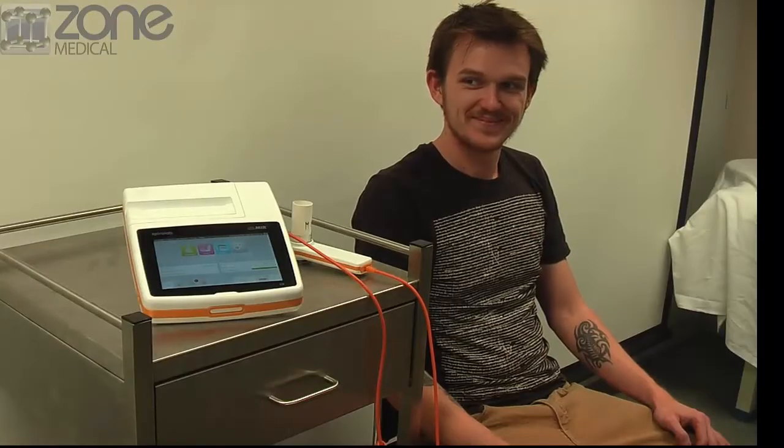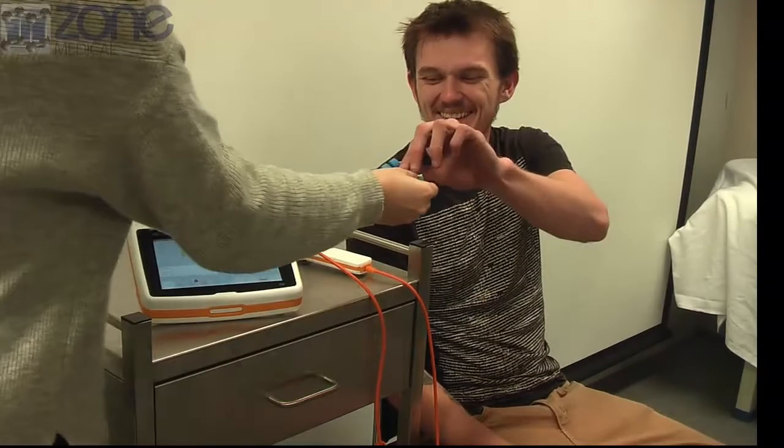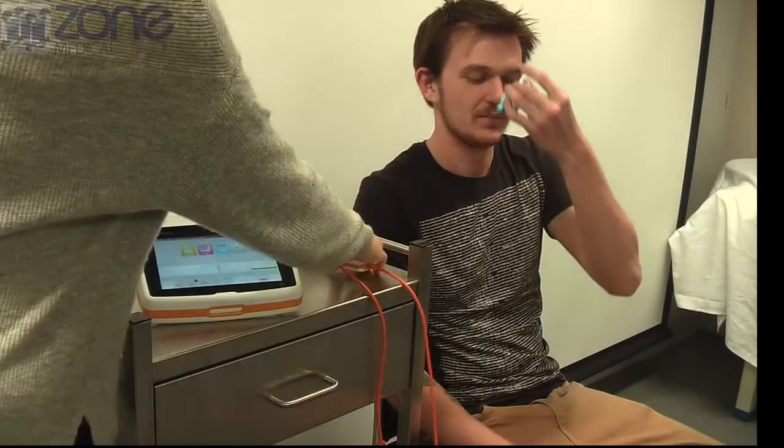The patient can then have a test try. It is vital to show the patient how to use the mouthpiece and get them familiar with it.